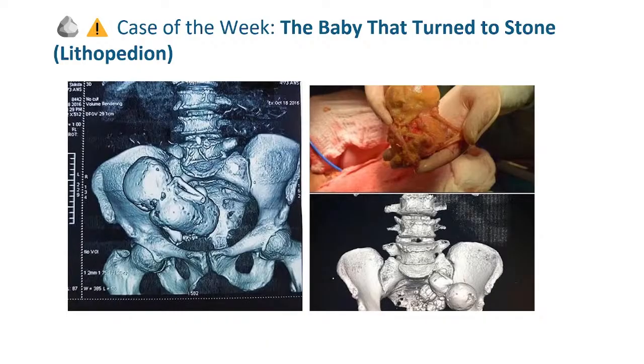So let's go straight into the case. This is a very fascinating presentation and a very fascinating case that I have never seen before in the history of my career. So fasten your belts and let's get to business. This is the case of the week, the baby that turned to stone, which is called a lithopedion.